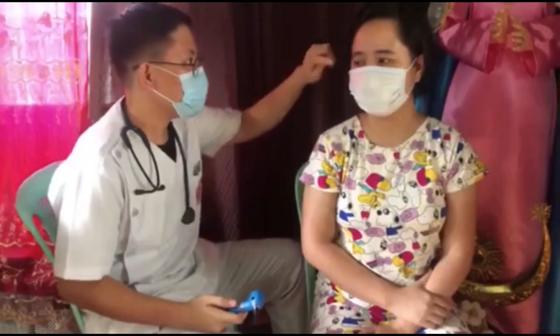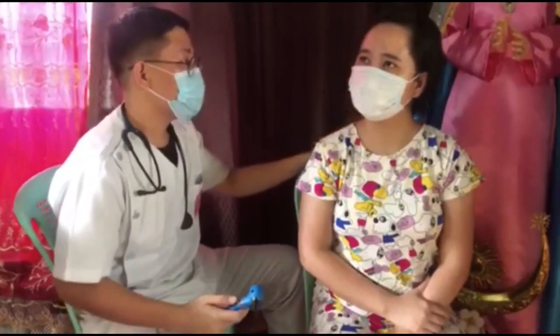So I'm Dr. Ortega and I'll be performing ear examination to our patient. Good morning, ma'am. Can you state your complete name? I'm Andrea Ortega. Okay. So before we start, we should ask the patient, have you felt any recent pain or tenderness in your outer ear?